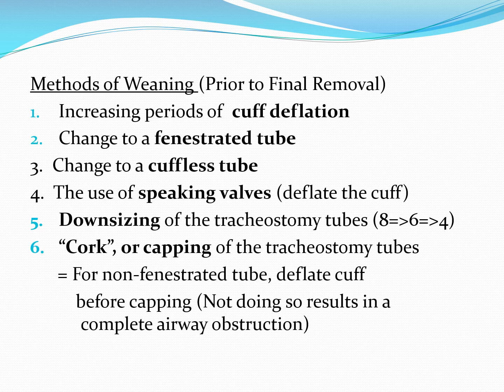One very important point to keep in mind is that for non-fenestrated tubes, the cuff needs to be deflated before capping. Not doing so would result in a complete airway obstruction, and that's a case where you've harmed the patient. You didn't make them better, you've harmed them, and we just need to be mindful to make sure that does not happen.